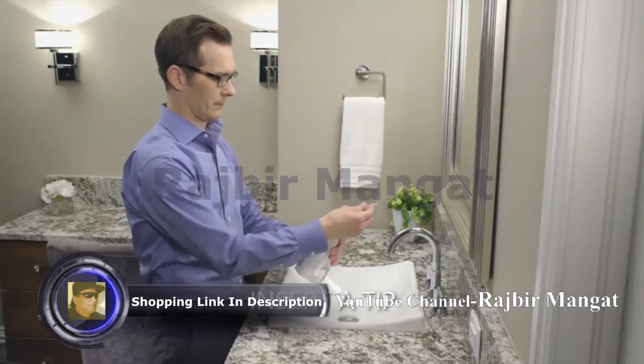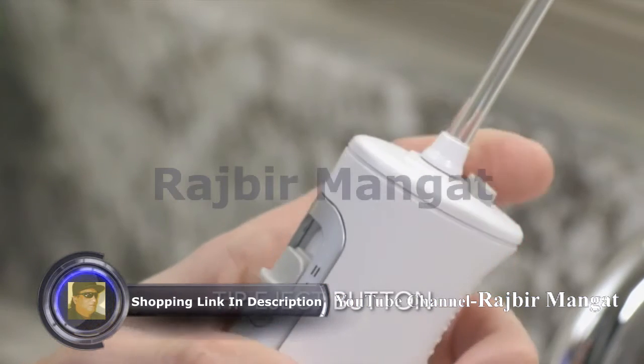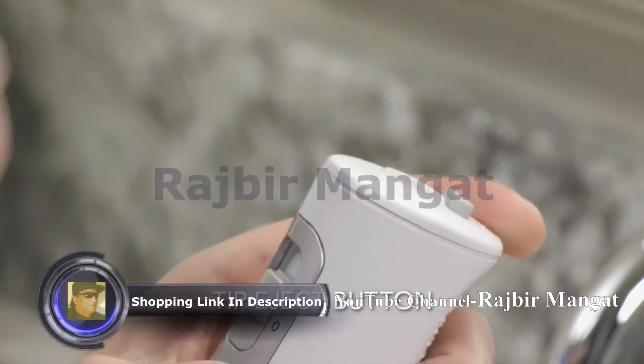Next, insert a tip firmly until it clicks into place. To remove or change the tip, press the eject button located on the top of the water flosser.